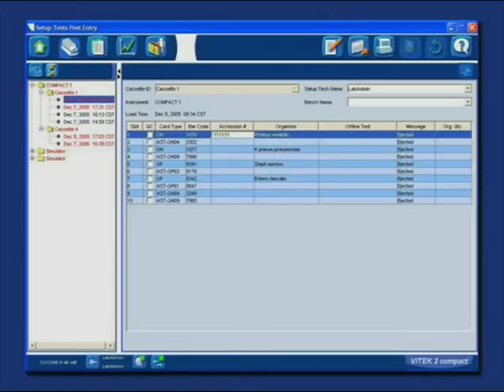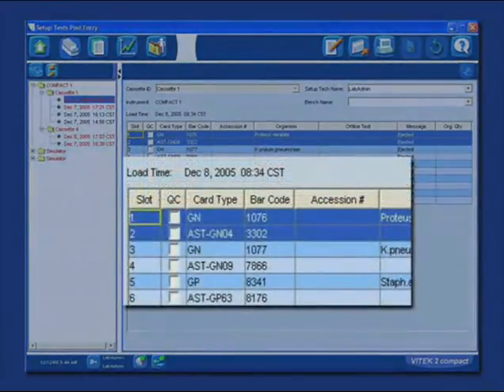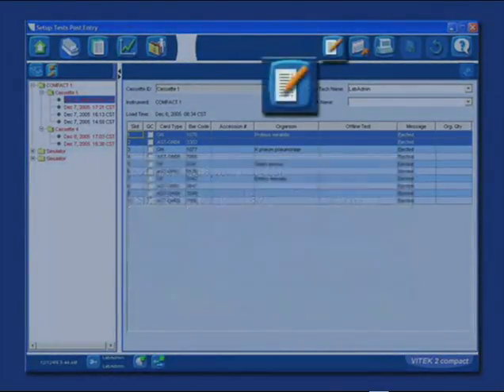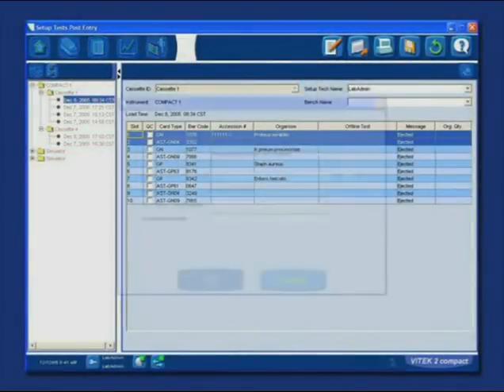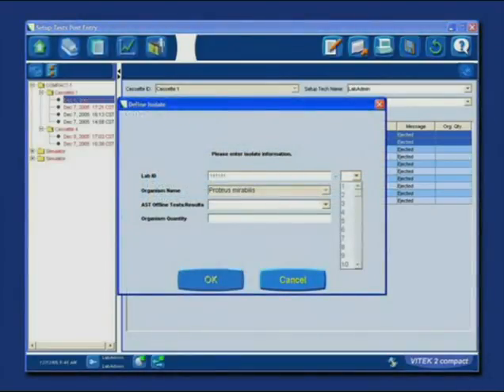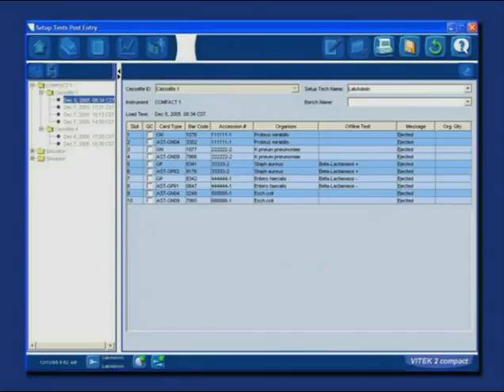To create an isolate group, click on a slot and drag the cursor to highlight all slots to be included. Click on the Define Isolate icon in the action bar and enter all isolate group information. When information for all isolates and isolate groups is entered, click Save.